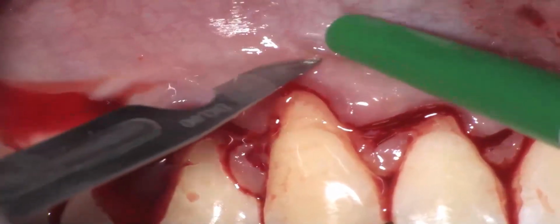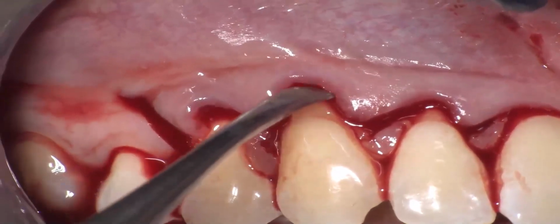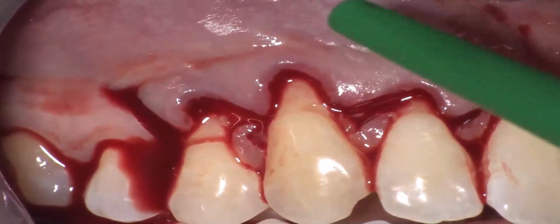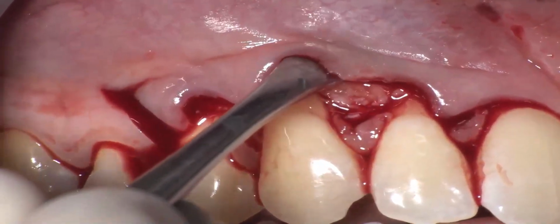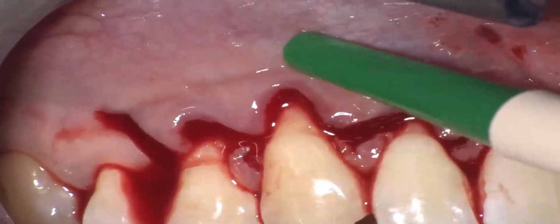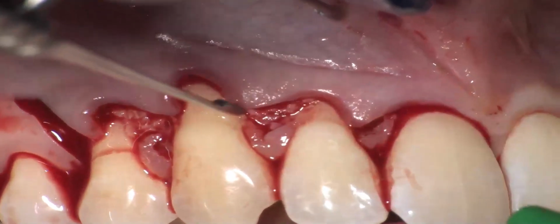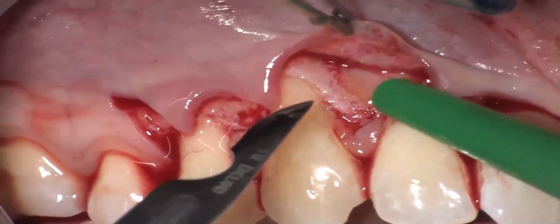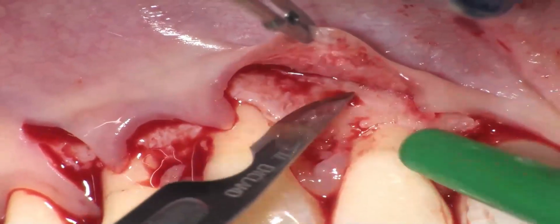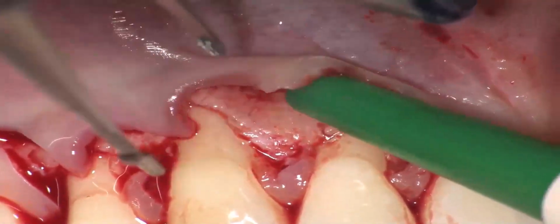This is a very difficult area. You see the keratinized tissue and the alveolar mucosa are very, very close to the bone, so I prefer to overlap this area with a full thickness flap elevation, because the risk of perforation in this area is very high. And I will show you by using this method what this deep incision means, that the muscles of the alveolar mucosa have to be detached from the periosteum. You see that now they have been detached.